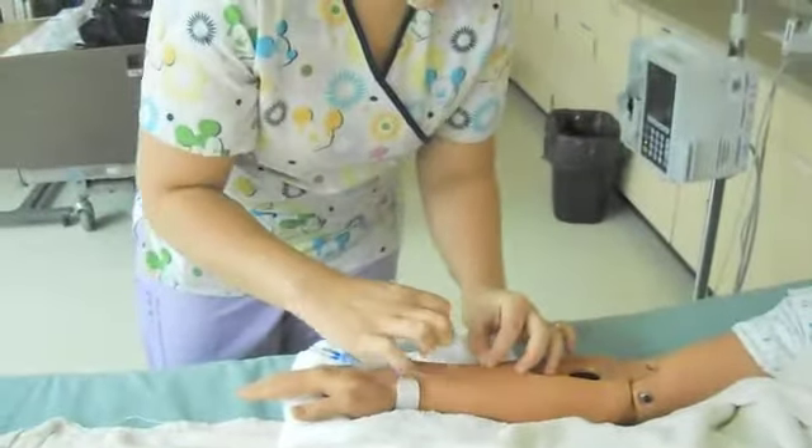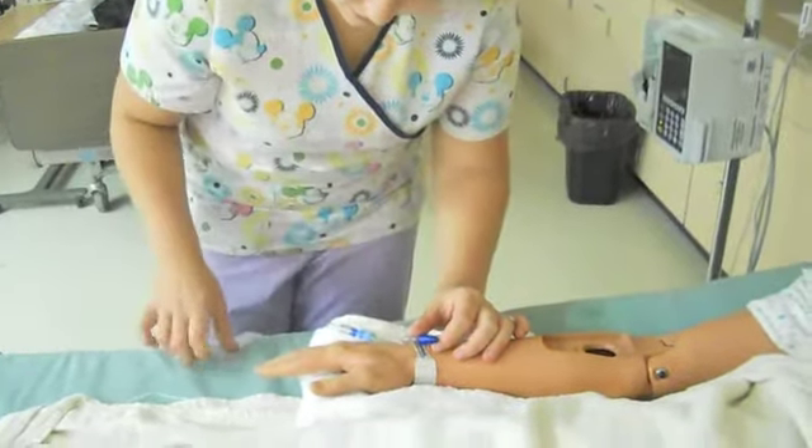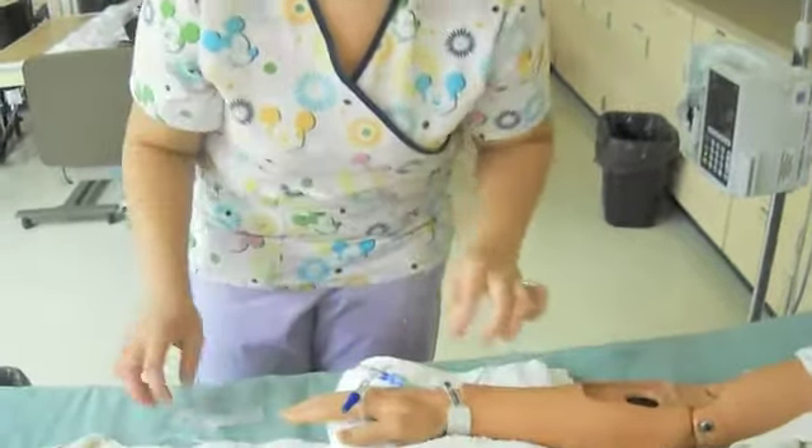First I'm going to remove the tape here, and also while I'm doing this, looking at the site, making sure it's not infiltrated, there's no phlebitis, make sure he's not in any pain at all.